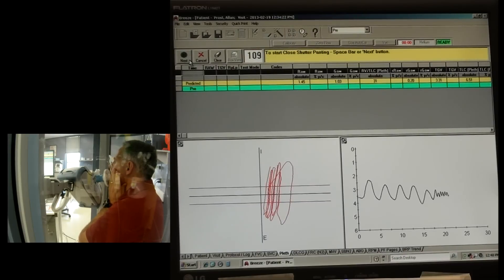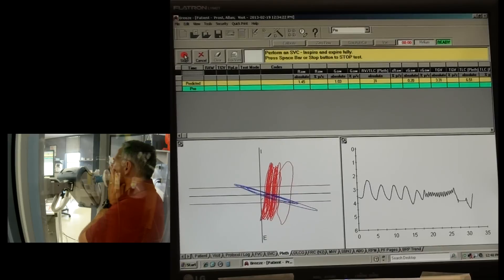In, out, in, out, in, out - one, two, one, two, one, two, one, two. Good frequency, about one per second. Now we're going to click the shutter closed. Now keep panting - one, two, in, out, in, out. All over for the panting maneuvers.